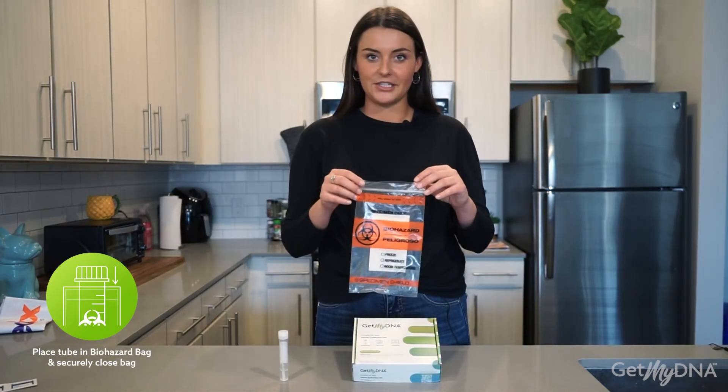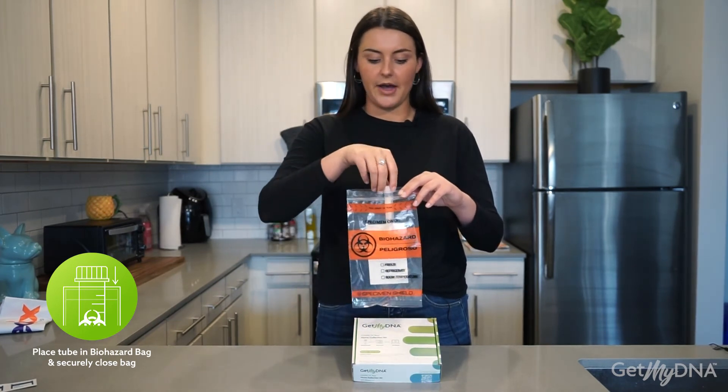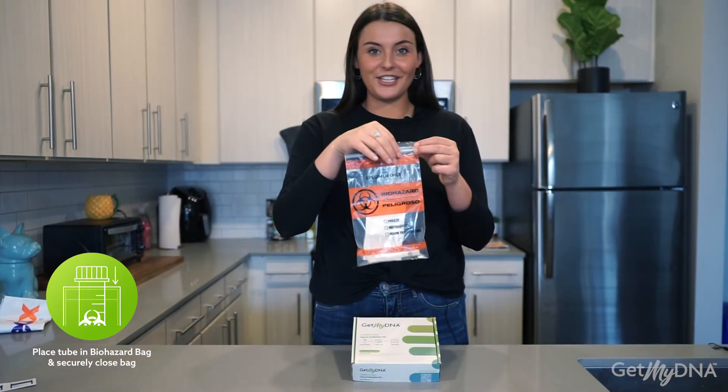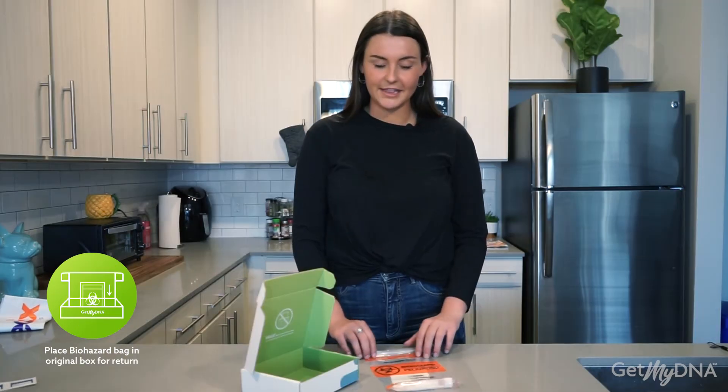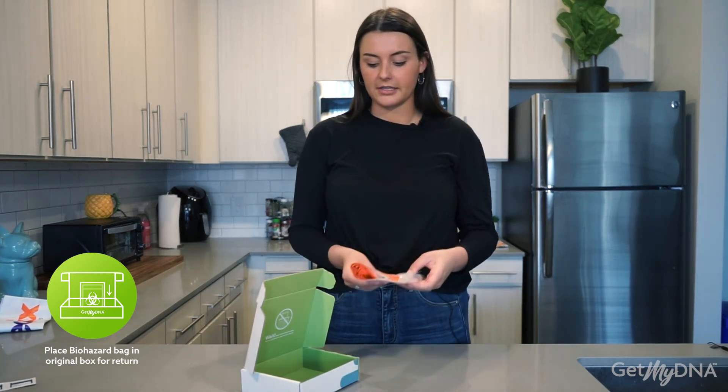Locate your biohazard bag provided to you in your kit. Take the collection sample and place it in the biohazard bag in the same section as the absorbent pad. Securely close your biohazard bag. Take the biohazard bag containing your collection sample and place it in the box that your kit came in.